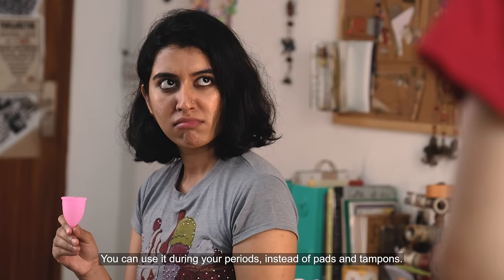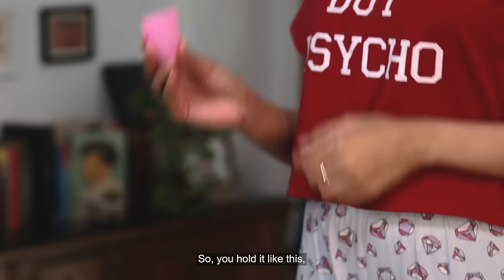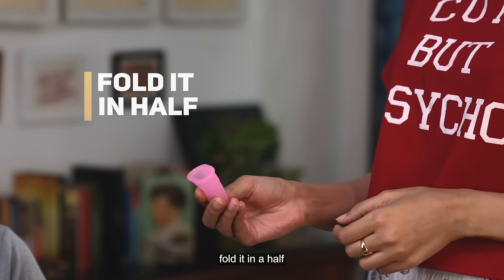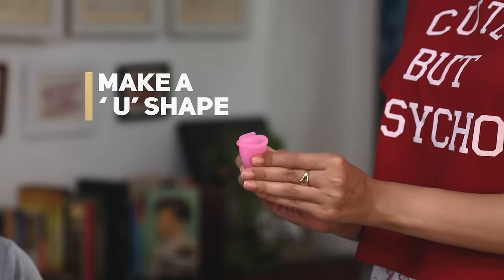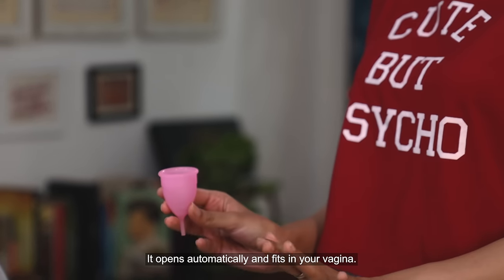You can use it during your periods instead of pads and tampons. Wait, I'll show you. So you hold it like this, fold it in half, and make a U. And insert it. It opens automatically and fits in your vagina.